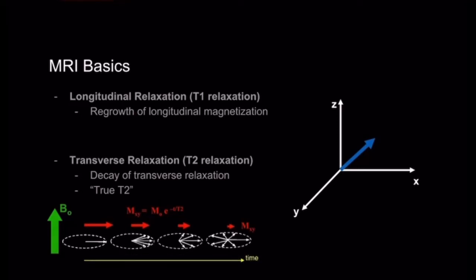Knowing this, we can see that the T2 relaxation time is always less than the T1 relaxation time. In other words, T2 relaxation happens more quickly because, again, anything that causes T1 relaxation also causes T2 relaxation, plus loss of phase coherence causes T2 relaxation. So T2 times are always lower than T1 times.